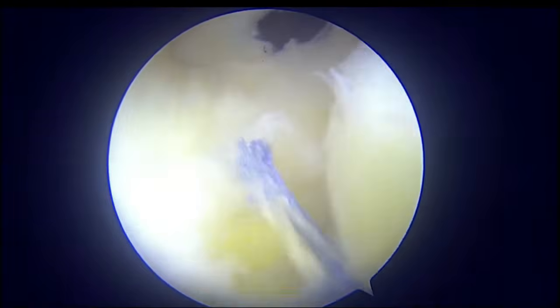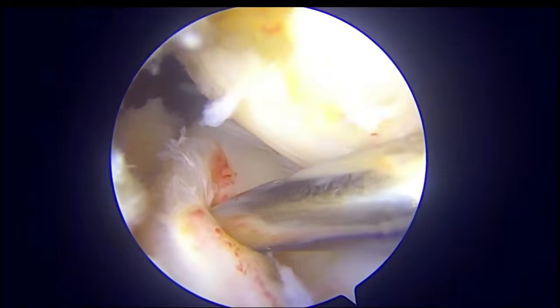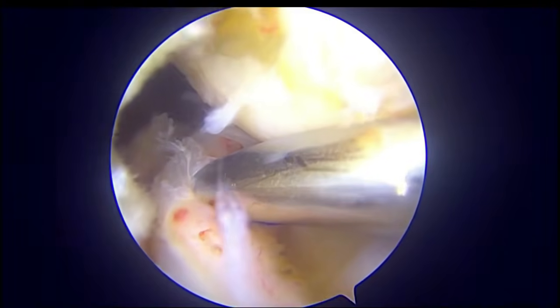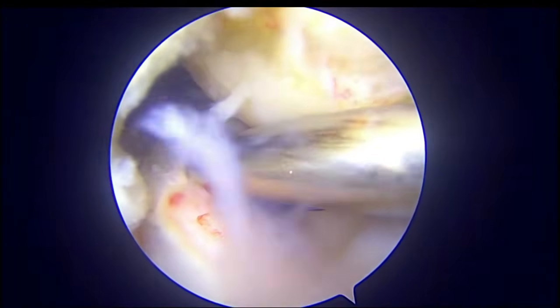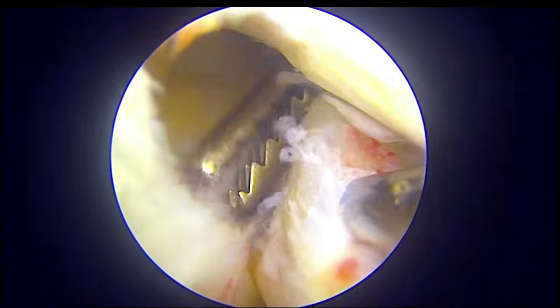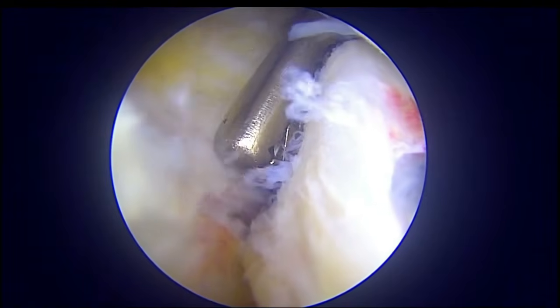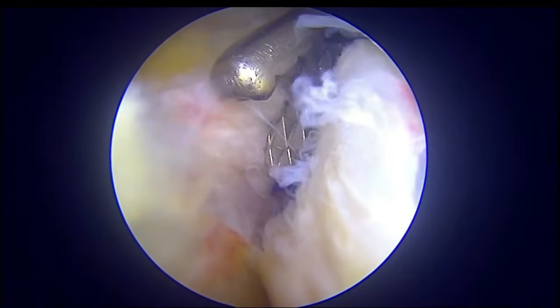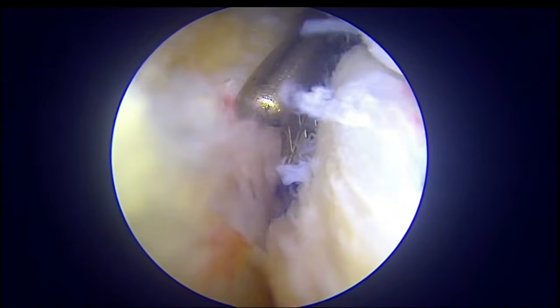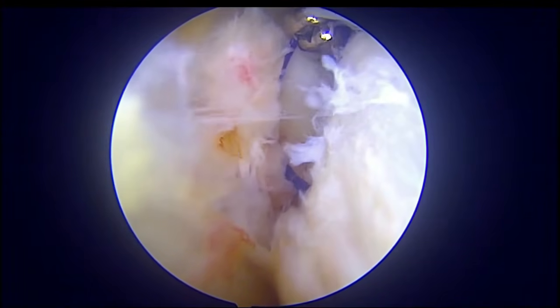So now two sutures have been put. For the third suture, I am pushing a number 16 cannula with a Prolene suture inside from the anteromedial portal, and then trying to grab the Prolene suture from the posteromedial portal. I am using the grasper to grab the Prolene suture from the posteromedial portal.